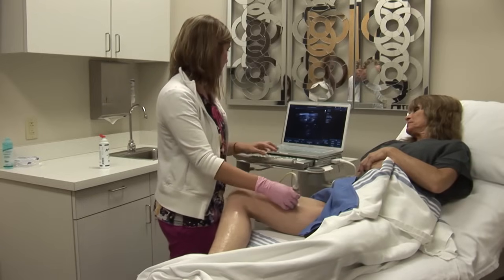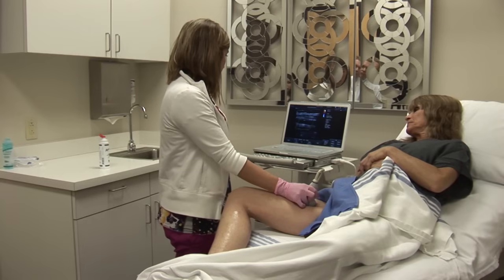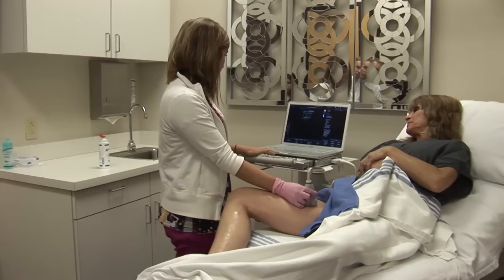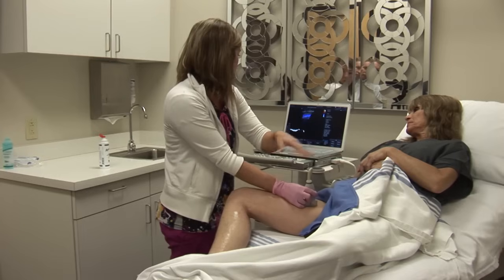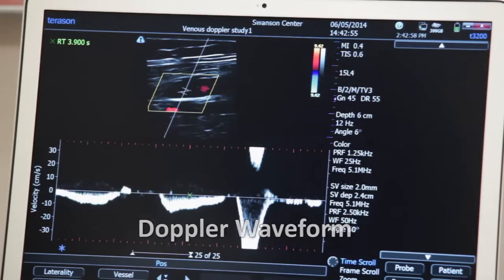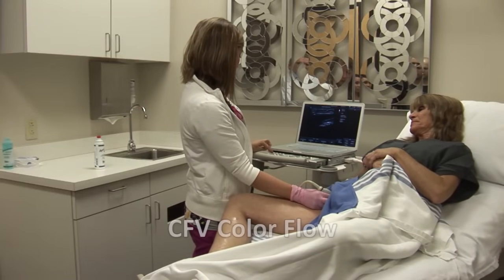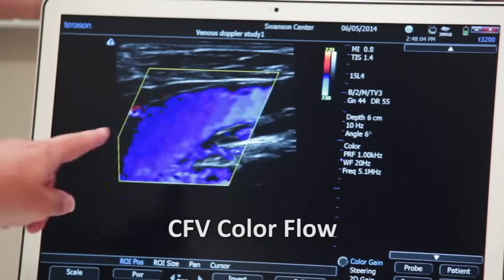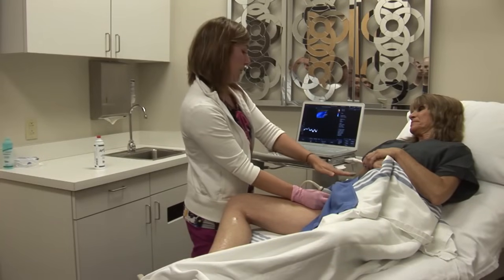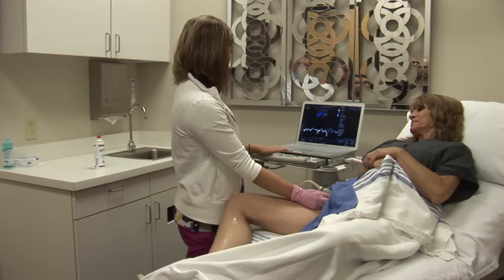And then we just keep going proximal to the thigh — nice color fill. You can hear the augmentation, and there's a nice spike again for each. Now we're back to the common femoral vein. I'm going to turn my color doppler on and show my nice color fill here, then my pulse wave doppler. I'll do my proximal augmentation first, then my distal — got a nice spike for each.